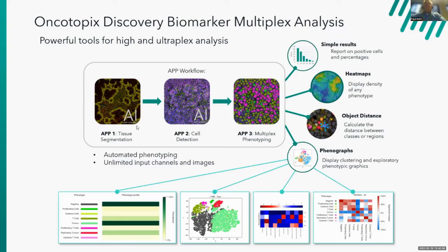The next step we're going to do is take that segmented image. And actually, at this point, if you wanted to, you could simply say, for each segmented object, please give me the expression of every single biomarker or other signal within the boundaries of every single object, every single cell, and give me its XY location. I can generate a massive data table for the billions of cells that I've identified. I can hand that off to my data scientists or whomever else, and they can work with data tables to give us some quantitation.